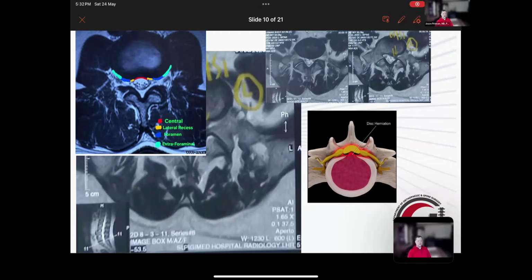I think with drains and the biportal technique, I still place a drain after every surgery. The concept there is not for prevention of a hematoma like you would in open surgery, but to allow exit or egress of all the irrigation fluid. But I've also talked to people that have been doing this long enough that they've stopped placing drains because they haven't seen the hypothetical value in reality.